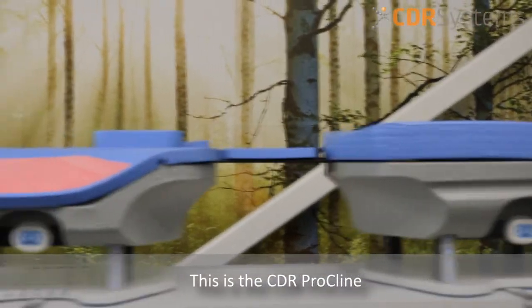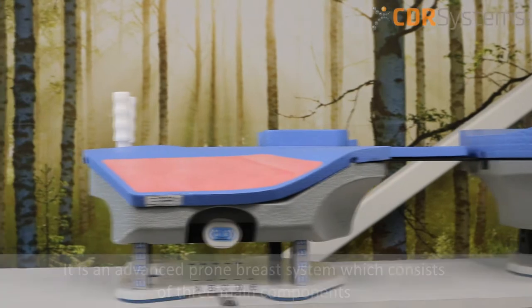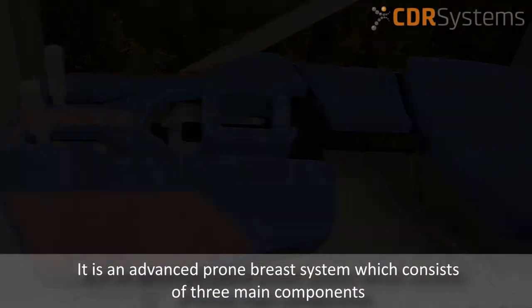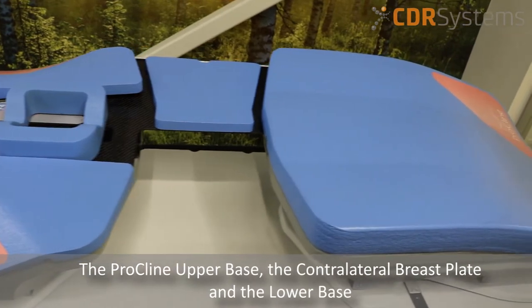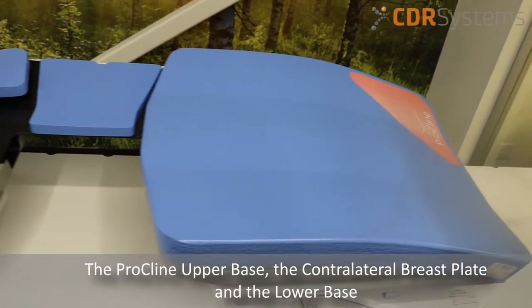This is the CDR Procline. It is an advanced prone breast system which consists of three main components: the Procline upper base, the contralateral breastplate, and the lower base.